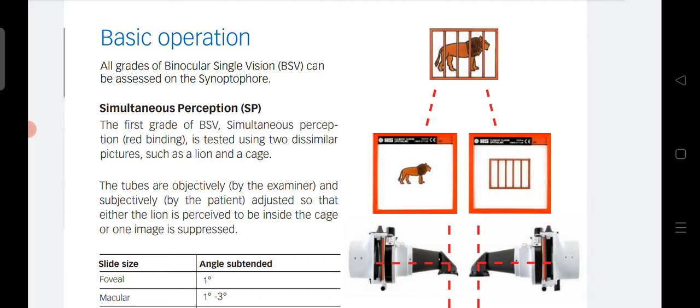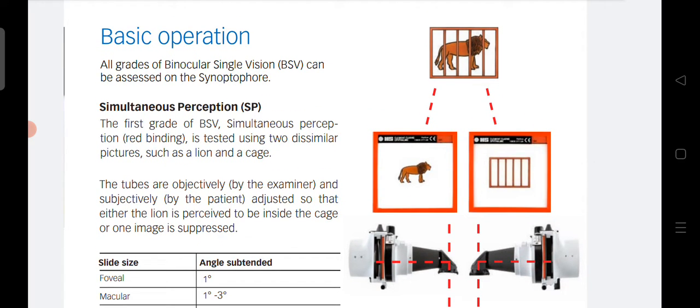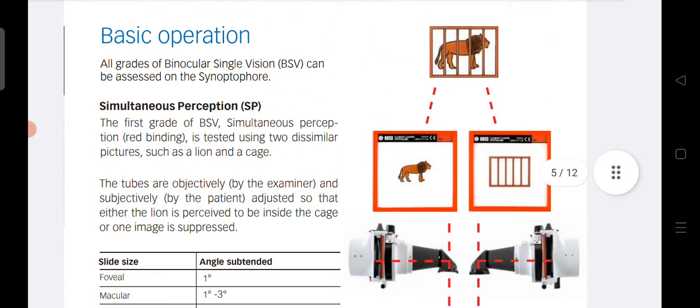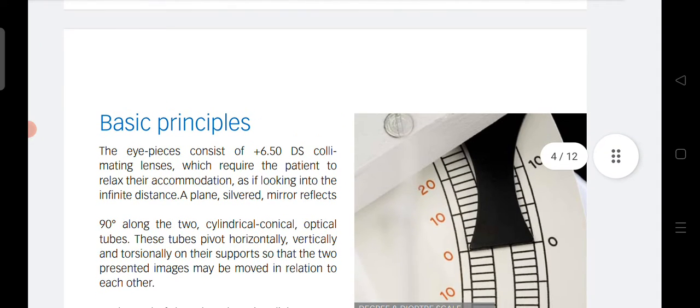Ask the patient what they see. If the patient sees the lion inside the cage, the angle of deviation is zero. If the patient tells that the lion is not inside the cage, you tell the patient to rotate the left-hand tube — keeping the right-hand tube fixed at zero. This zero marking is the reference for both sides.